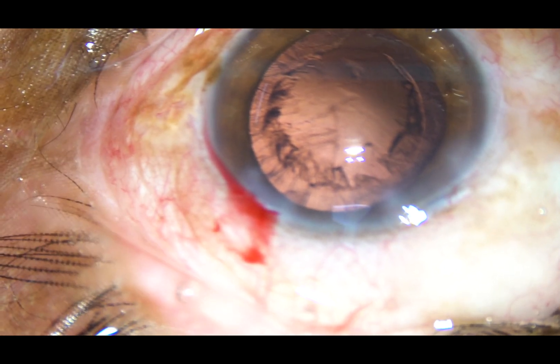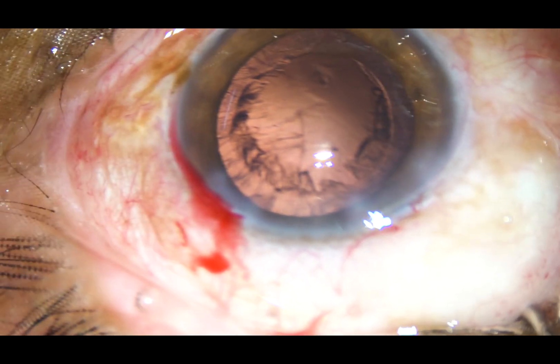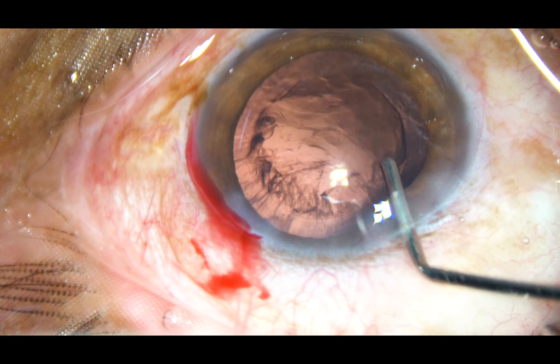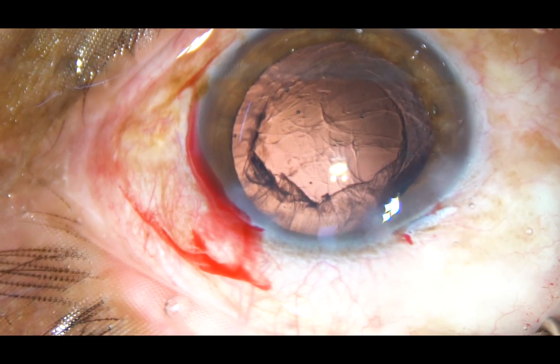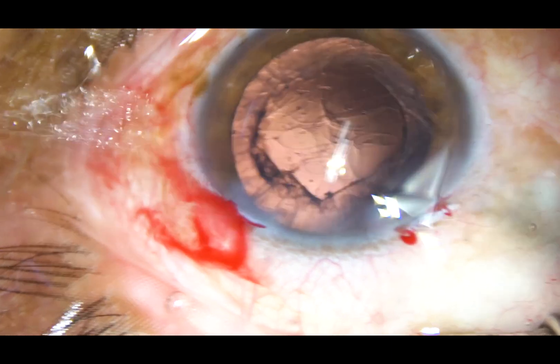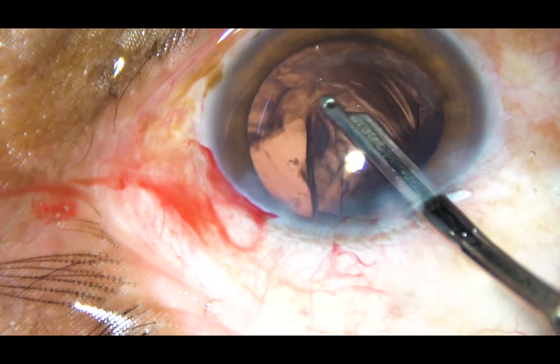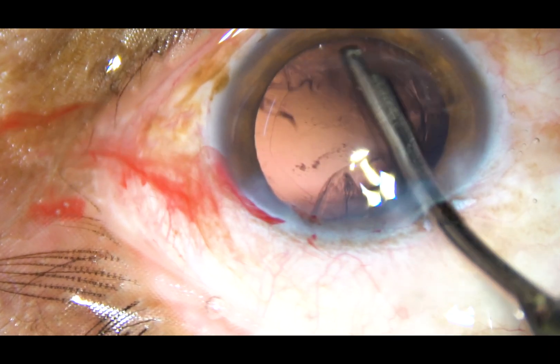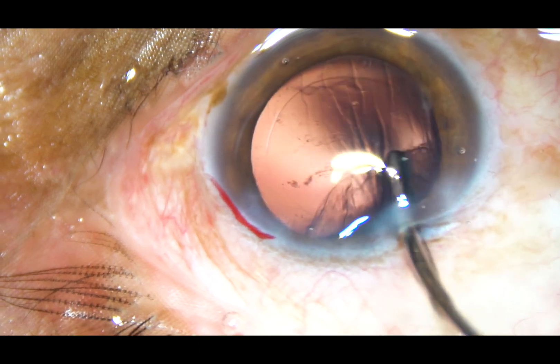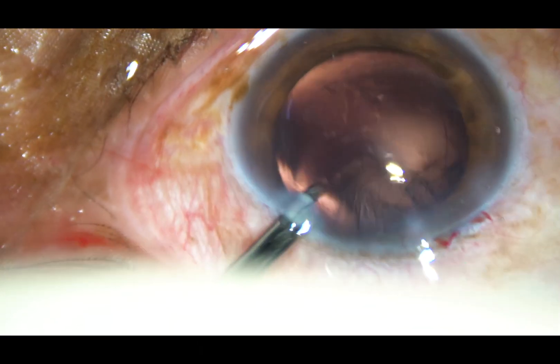Now cortical clean-up is to be done. I have made only one side port and I have decided to use a 23-gauge Simcoe cannula. A little bit of viscoelastic substance is injected — it keeps the anterior chamber formed and during this time I can remove the cortex. Most of the cortex from the inferior aspect is now removed.